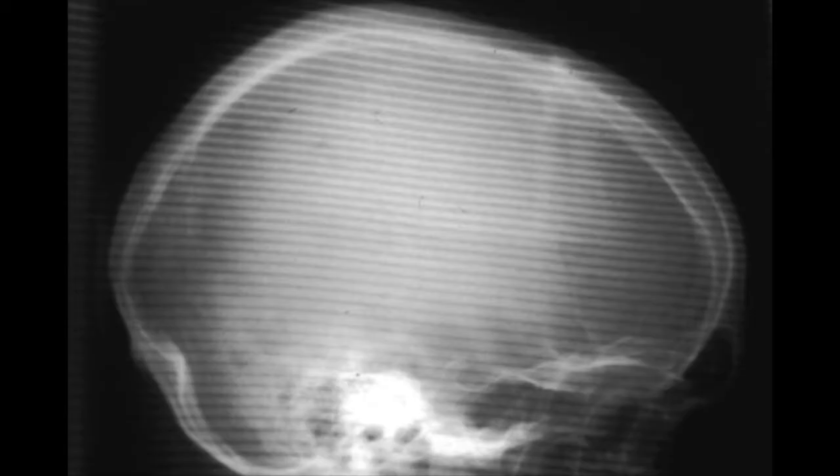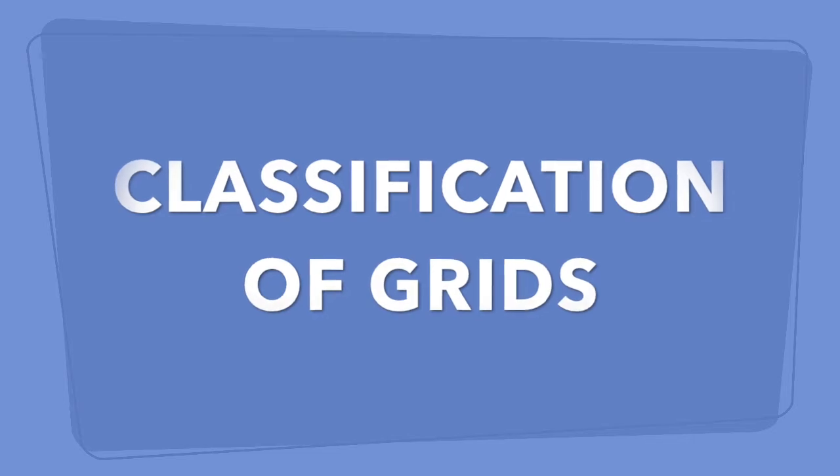The moire effect grid error happens with digital image receptors when the grid lines are captured and scanned parallel to the scan lines in the image plate readers. This produces the zebra pattern.